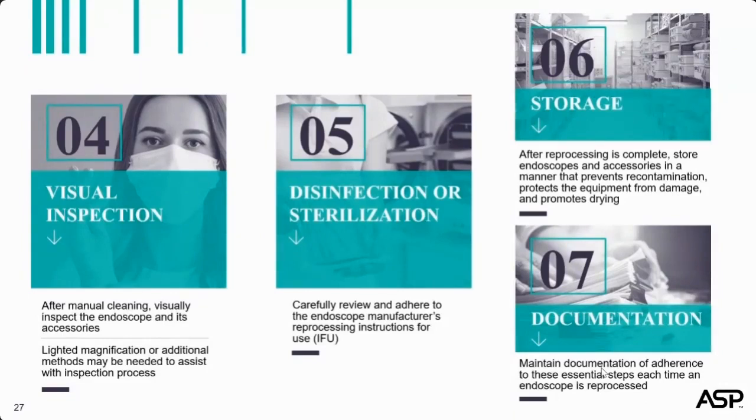And also on processing equipment. So when your PMs are due, you should be keeping track of that as well on the AERs. This information is available to anyone who goes onto the CDC website. So that audit tool I just mentioned.